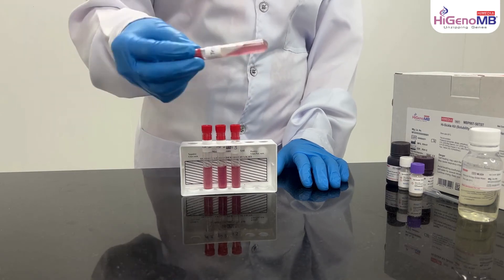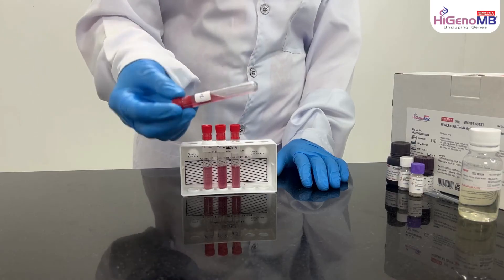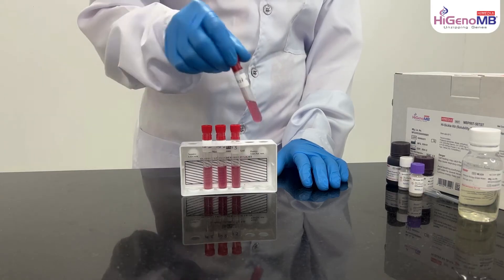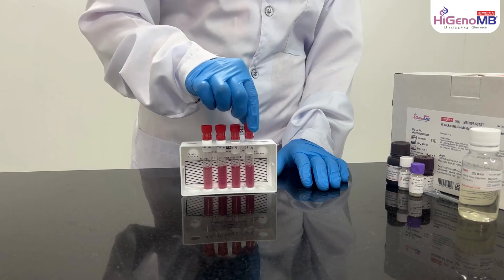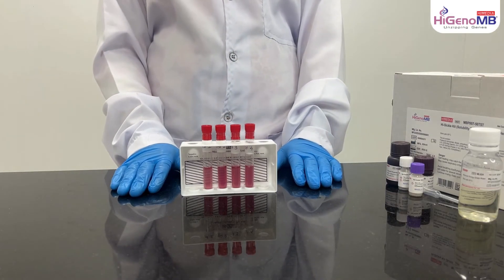Gently mix the tubes for 10 to 15 seconds. Allow the tubes to stand for 10 to 15 minutes at room temperature.